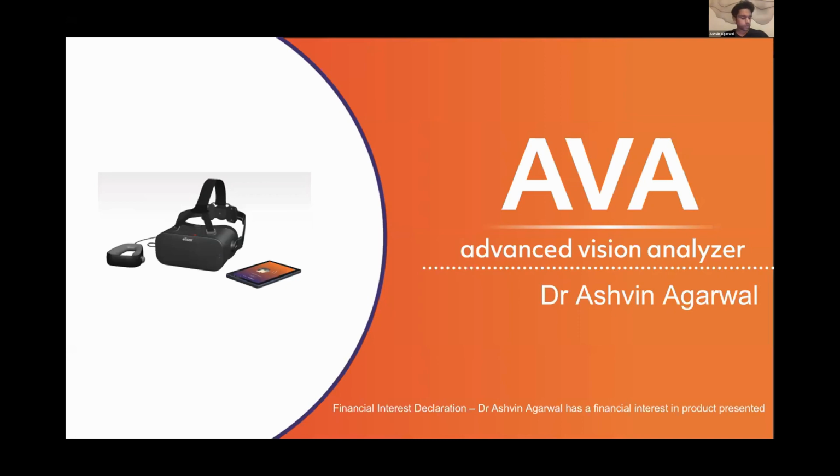I must confess first, I have a financial interest in this topic, the Advanced Vision Analyzer. It's a diagnostic device which basically helps us measure the visual field of a patient. How does this machine work? Let's just go through with the program.